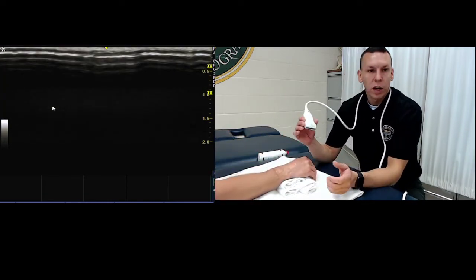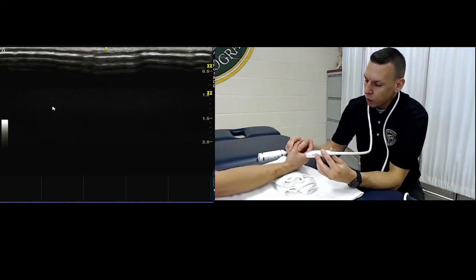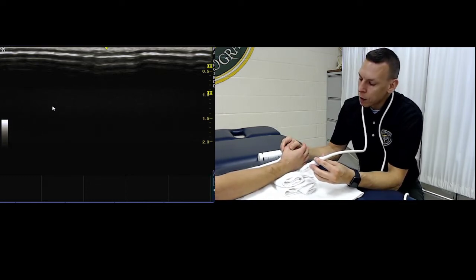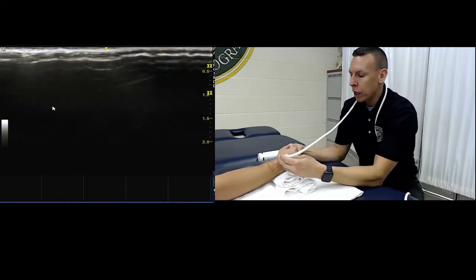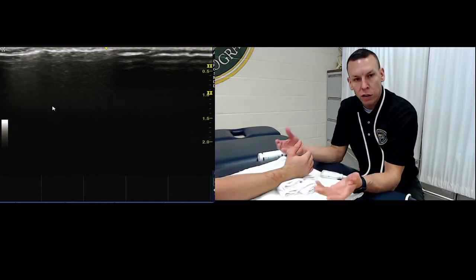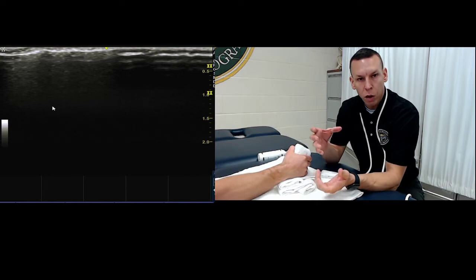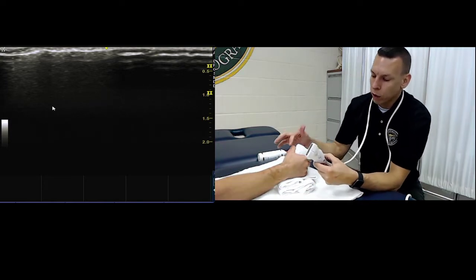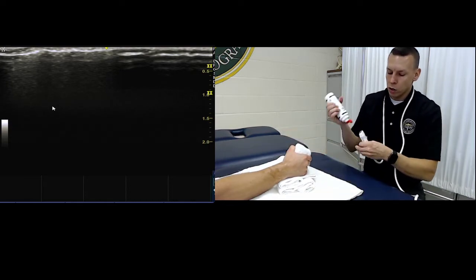All right. The last thing we're going to image is the ulnar collateral ligament of the first MCP. This is quite an important structure for looking for gamekeeper's, looking for a Stener lesion. With the hand up here, I like to have them hold on to a towel, like you can ball it up and have them hold on to it. If they can tolerate this position, it gives you a good area to scan that structure.